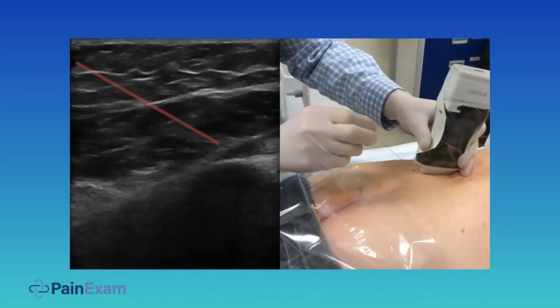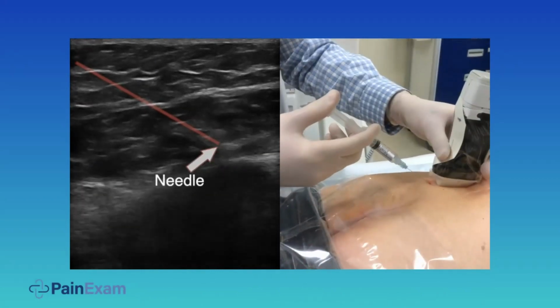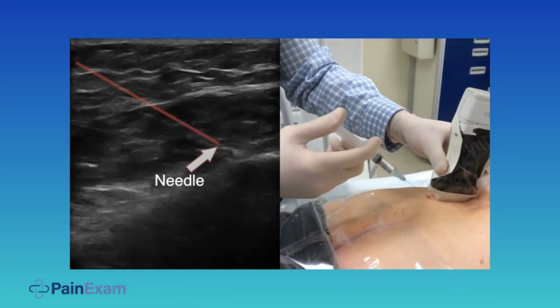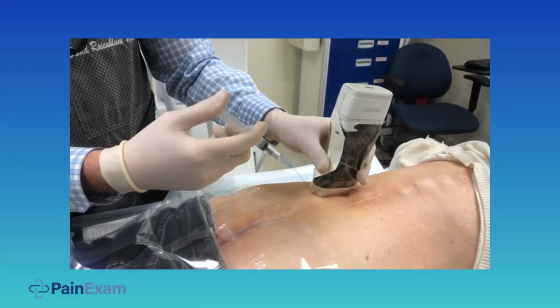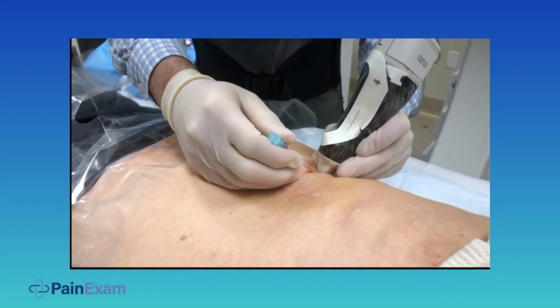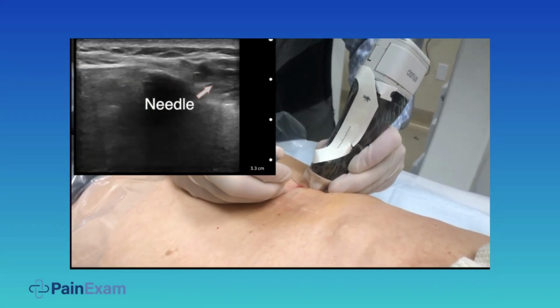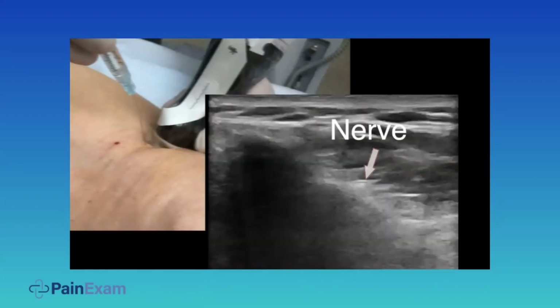Now this is a patient who originally had a sacroiliac joint injection as well as gluteal trigger point and gluteal bursa injection without any long-term relief. On exam, she did have a positive Tinel's near the iliac crest, right where my needle is and where I'm working. What I did first is a longitudinal view, and I identified and anesthetized a medial branch of the cluneal nerve.